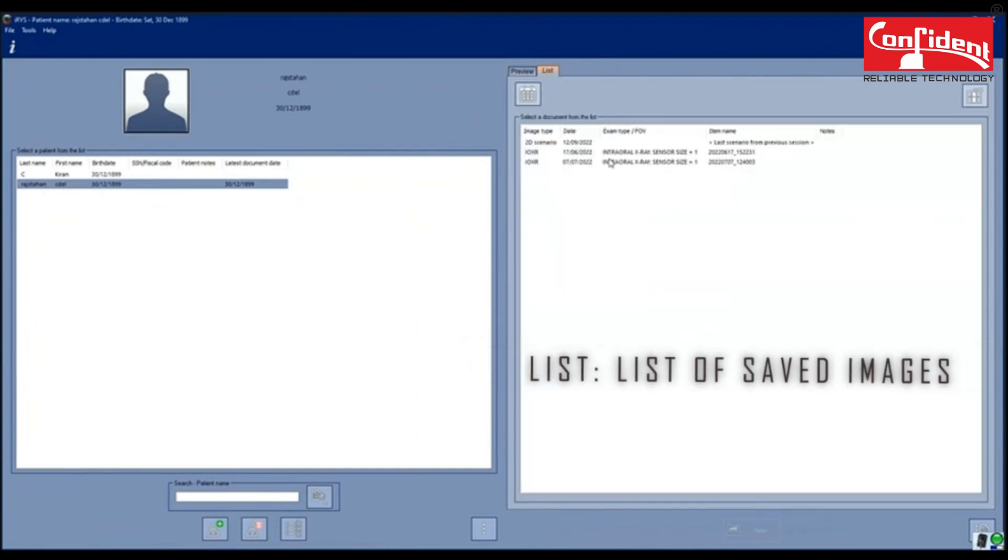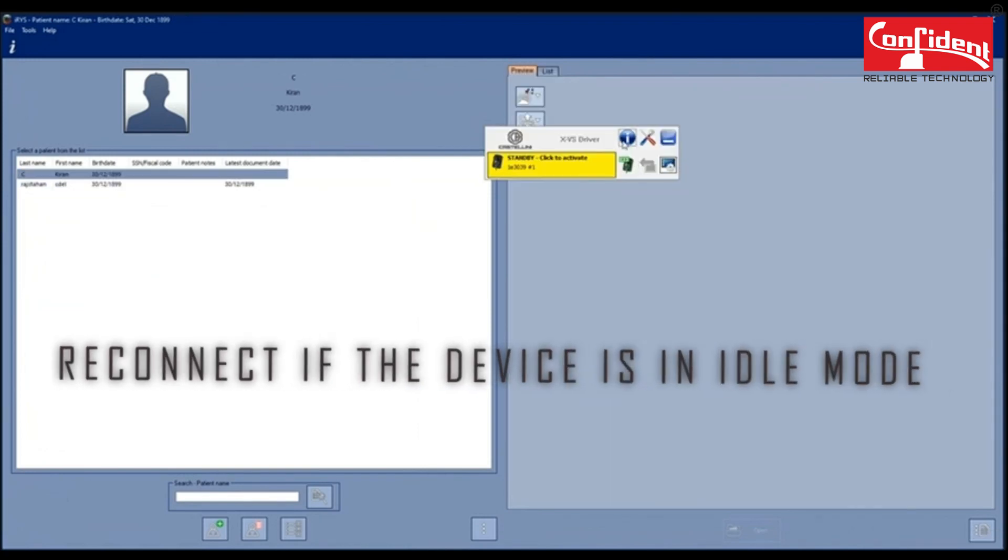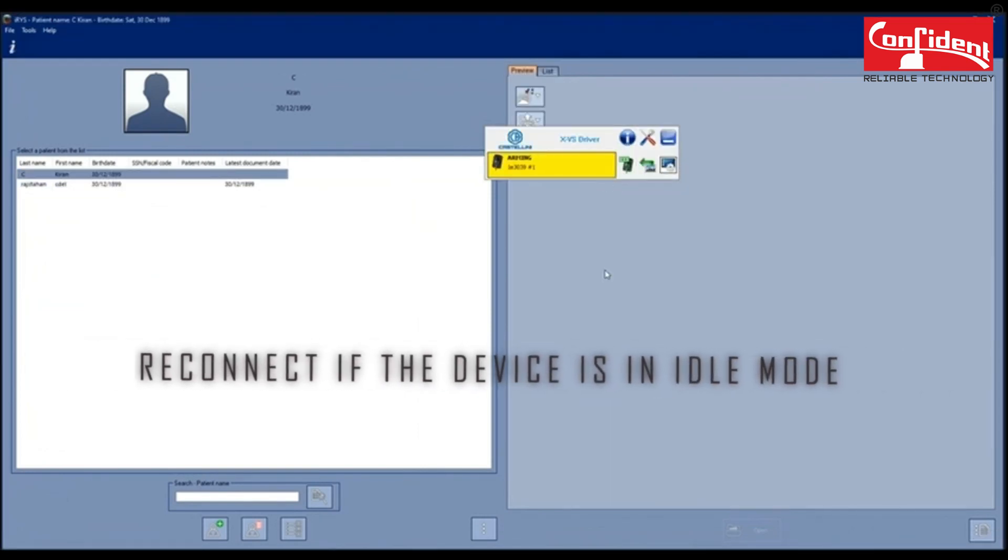Under List tab, you can see the list of the scanned images, reconnect the server if it is in idle mode.